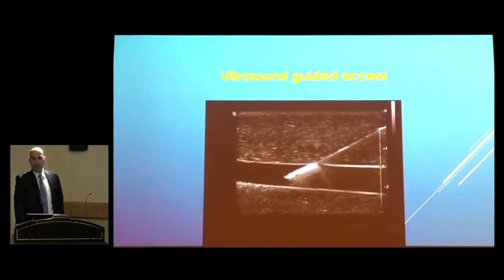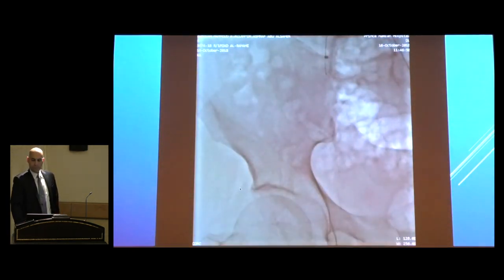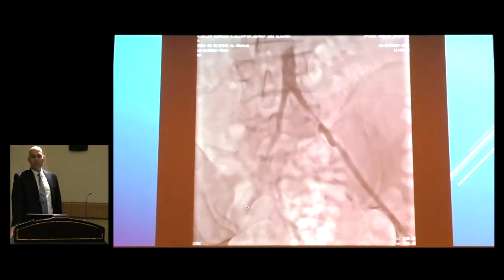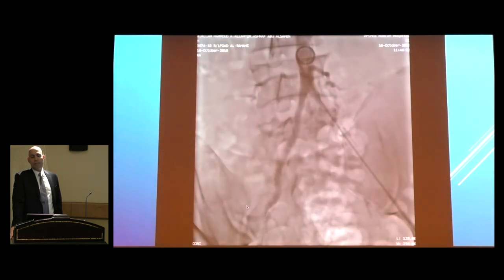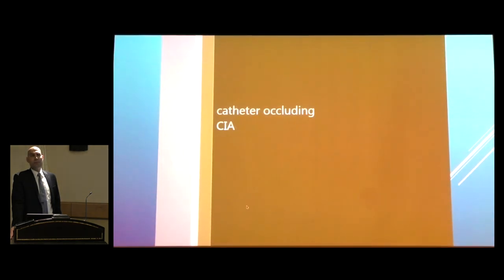We started the procedure with ultrasound-guided access. I do believe ultrasound-guided access decreases the risk of groin hematoma, pseudoaneurysm, and other access problems. I put a short 6 French sheath in the left groin at the beginning, and crossed that left common iliac. Here you can see the left common iliac near-occlusion — since it's a near-occlusion, once the pigtail was placed (a 5 French pigtail), you can't really see the external iliac or the common femoral.